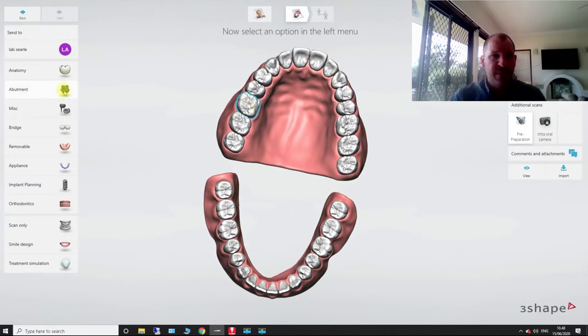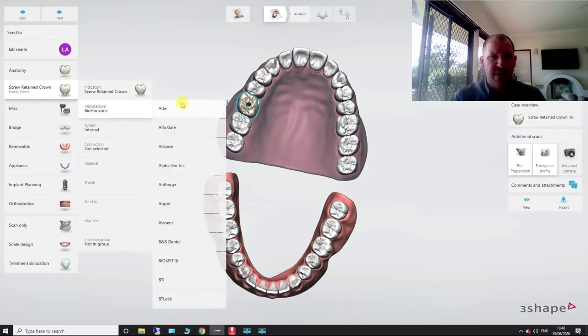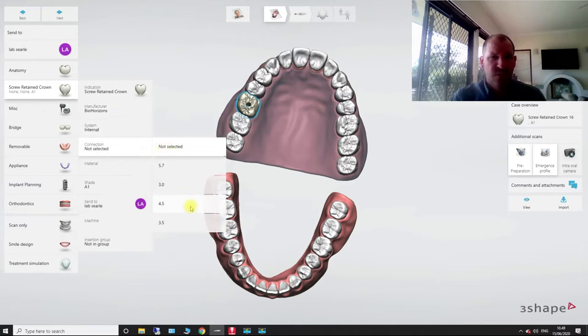I'm going to hit abutment. I'm going to say either abutment or screw retain crown. Let's just go with screw retain crown. I'm going to choose BioHorizon. And then after we choose that system, we can go tissue level, anchor pin, internal, obviously internal.